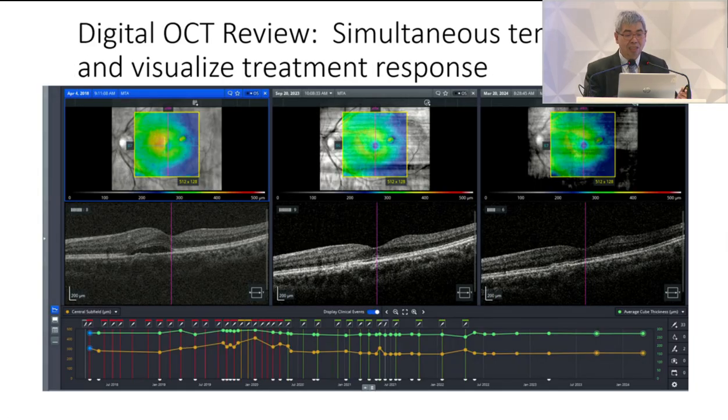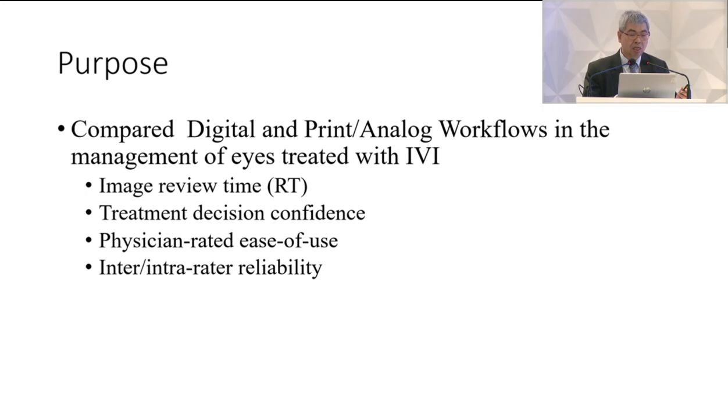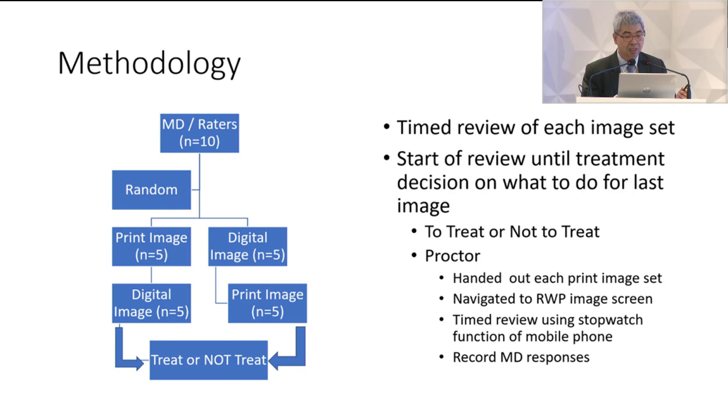More recently, digital systems have allowed us to simultaneously view all of the images from the patient's first visit, visualize the patient's response, and even quantify how well patients respond to the treatment. So we wanted to compare digital and print analog workflows in the management of eyes being treated with intravitreal injections.